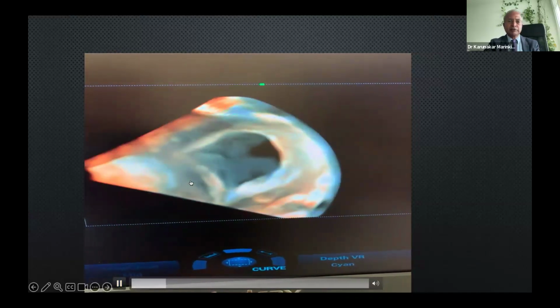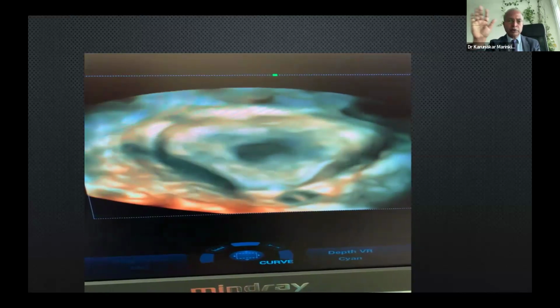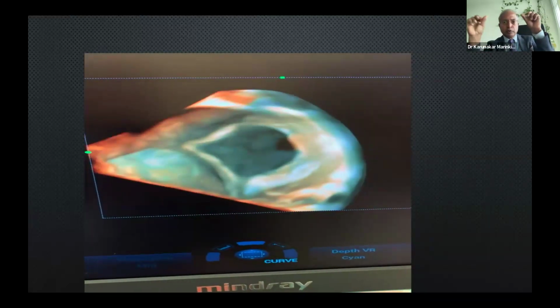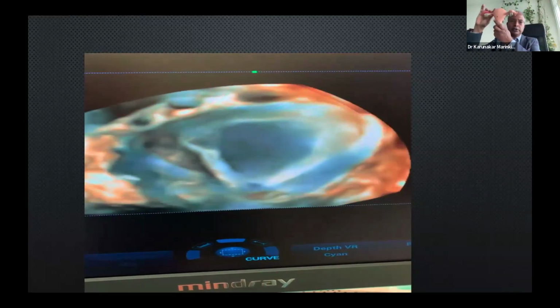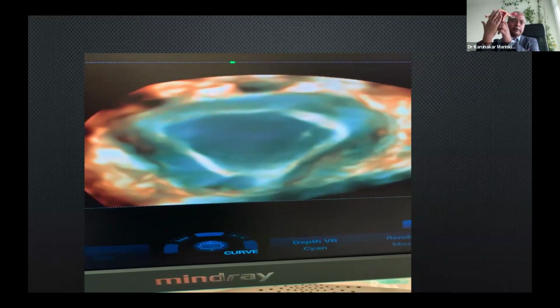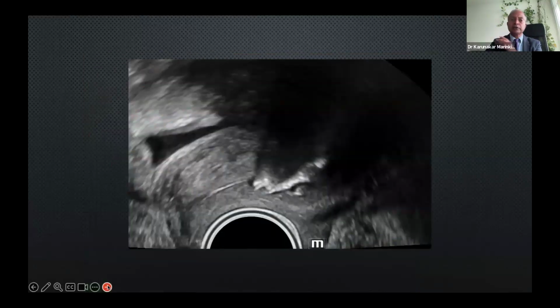So this is the left sagittal view. Without my knowledge, I went to the posterior anterior view, so I was not in the right plane. So then I just rotated XYZ planes. There are a few knobs you play called rendering. This is like rotating it. This is the AP view I'm doing. Previously, I'm trying to go on the back. Now I went to the front. So as you can see, myometrial outline, endometrial outline, the thickness of the endometrium, nothing in the endometrial cavity. 20 seconds, machine does it. 3D is a machine skill, not your skill.